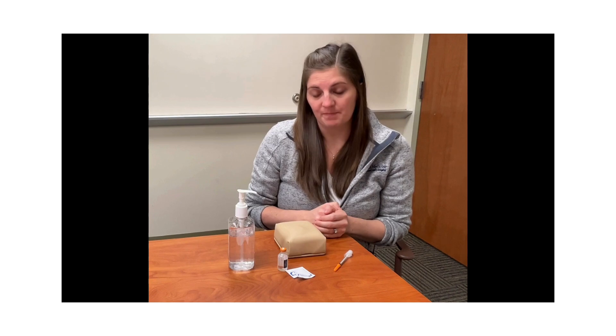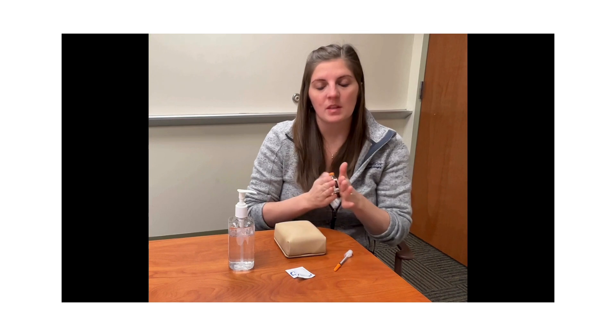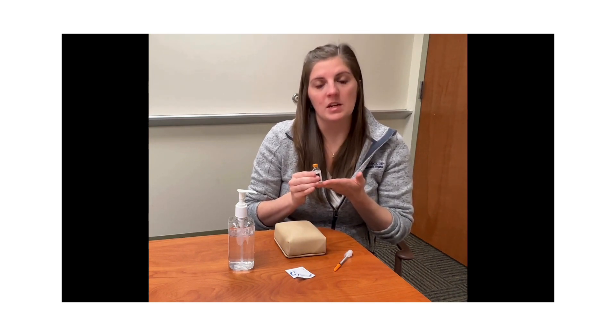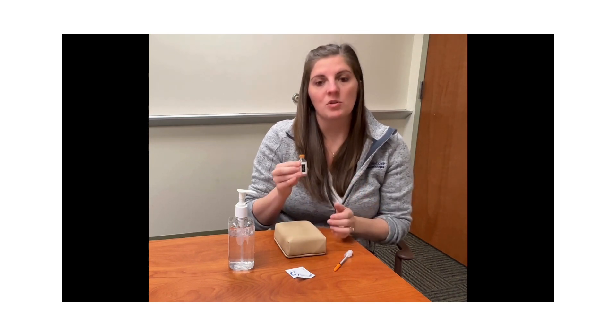If the insulin within your vial is cloudy, you will need to pick it up and gently roll it to make sure that you mix the insulin within your vial. If your vial has clear insulin, you do not need to mix.